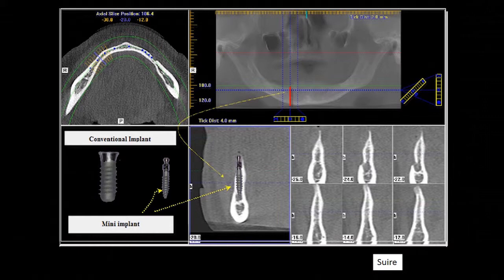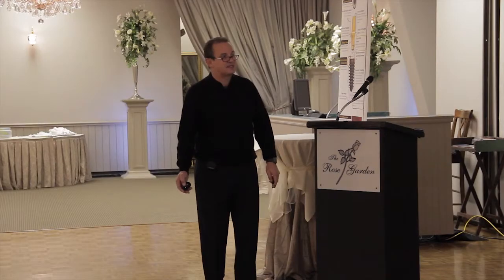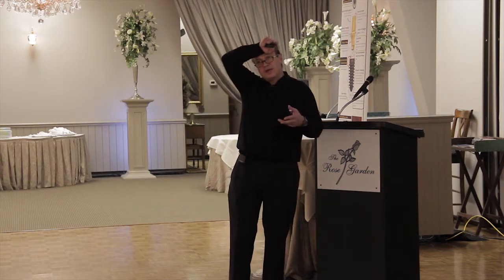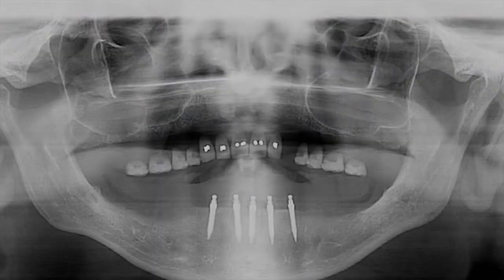This will. And so as far as treatment options go, real cost conscious and all these other kinds of things, it's like, well, look, you got these cortices that are almost touching each other. The only thing that we can use are mini implants in a case like this. Like I said, I don't do a lot of them. I did 4 this week. I probably hadn't done a mini implant in 4 or 5 months. It's been a long time, because I believe in the real thing. But for this case right here, which is working out real well, I think that was the treatment of choice.